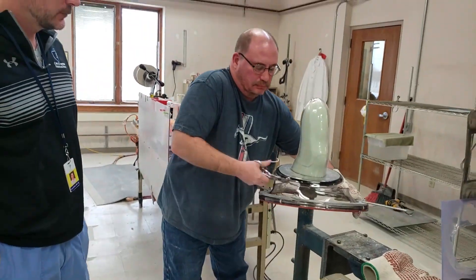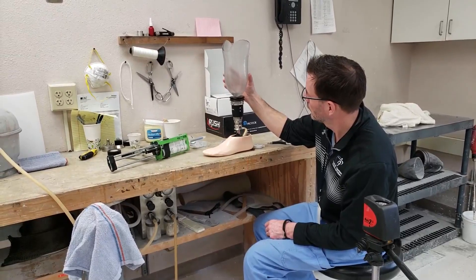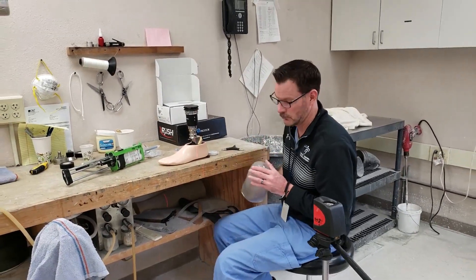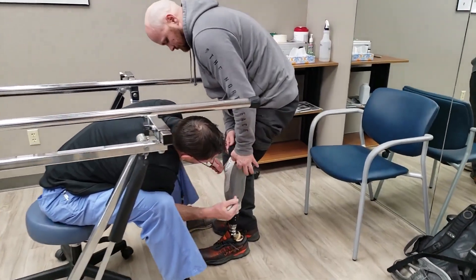The trimmed and finished diagnostic socket is quickly inspected for safety and sharp edges, then ready to be mounted to the other prosthetic components. We use the guidance of lasers to ensure that our alignment and weight lines are appropriate in accordance with manufacturer's recommendations.